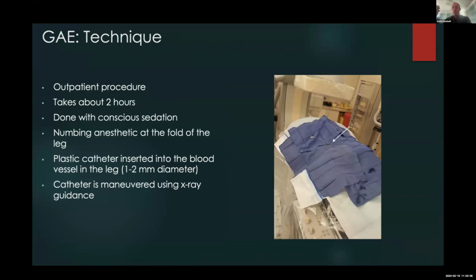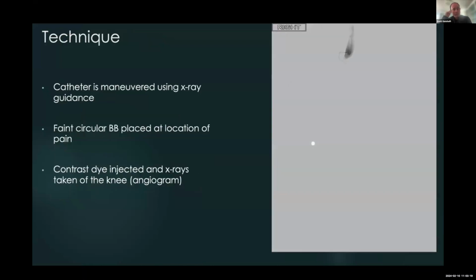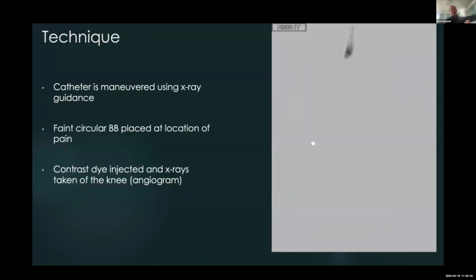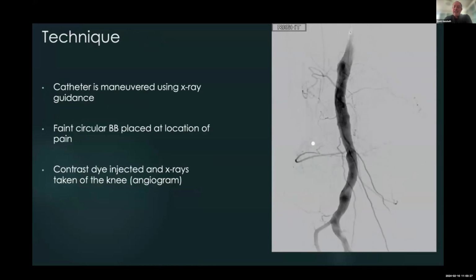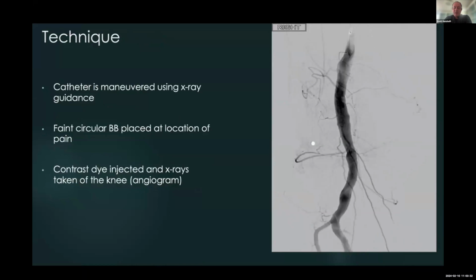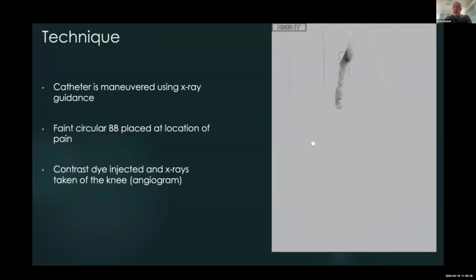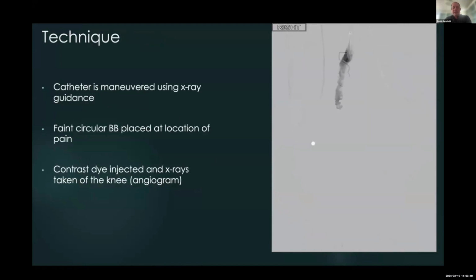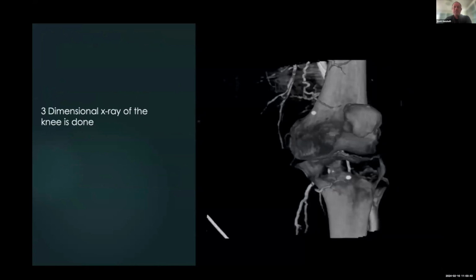We typically use a micropuncture sheath alone to get access, or a 4 French glide slender sheath to keep it really small. You do manual compression at the end of the case. Once we get access, we perform an angiogram, looking to make sure we don't have to send the patient to Dr. Vatican Sherry to work on their PAD. If they don't have any severe occlusions, which we've hopefully caught ahead of time in our clinical evaluation, we go ahead and evaluate the genicular arteries. You can see a number of the normal genicular arteries opacifying on this catheter angiogram.